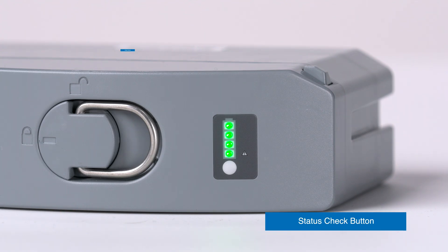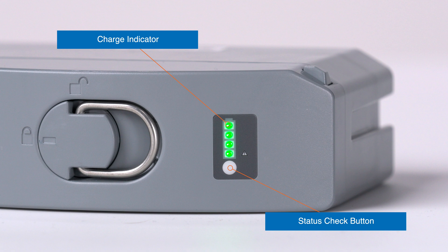Four green bars indicate the battery has a charge greater than 75% and is ready for use in the platform.